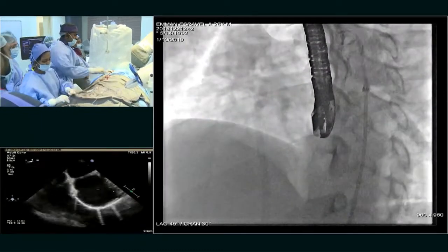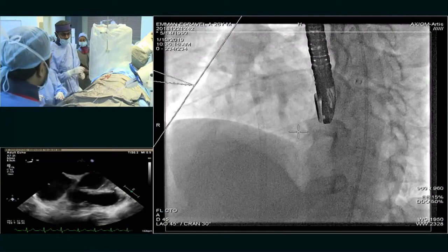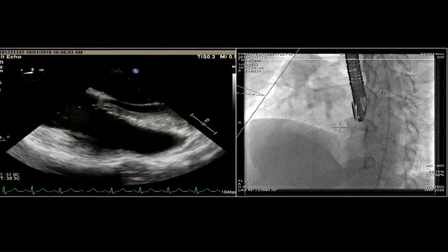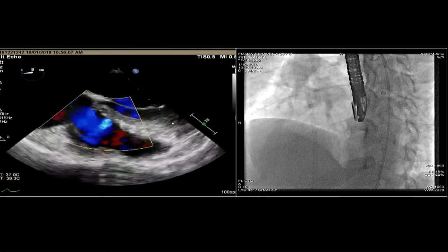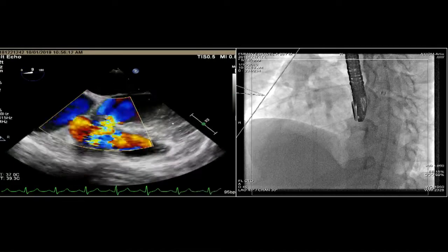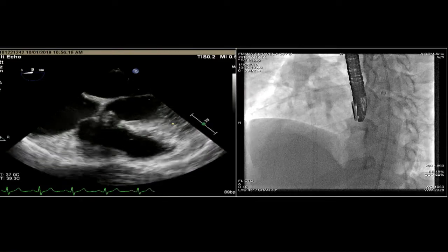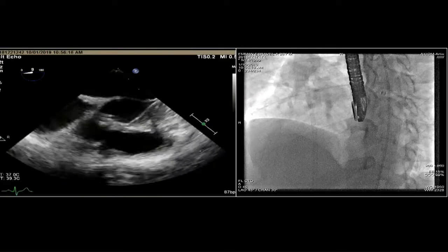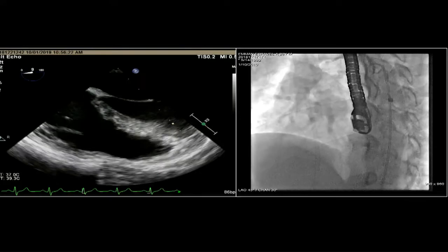Okay, so Ramya, can you show live echocardiography of the tricuspid valve? Yeah, get the color. Not much color flow into the right atrium, Dr. Bharat. So right now, yeah, 12-10. I would take the floor opinion about what to do.